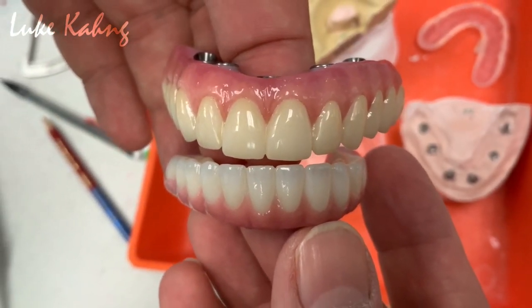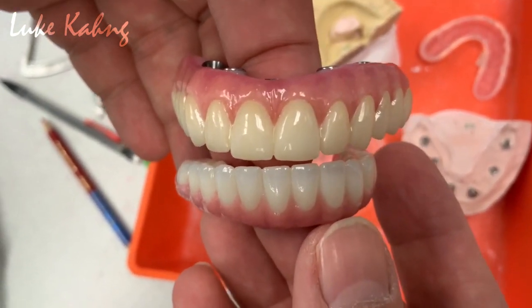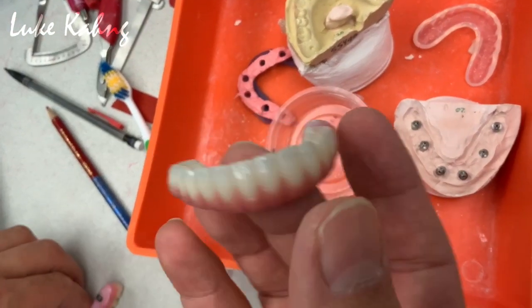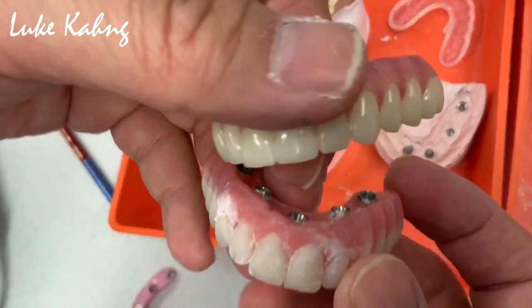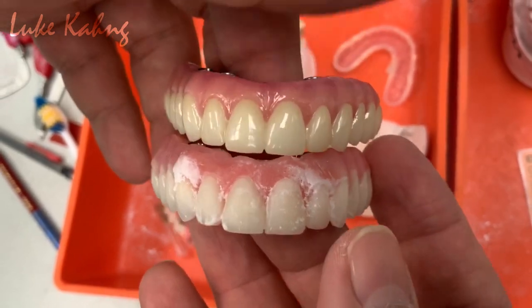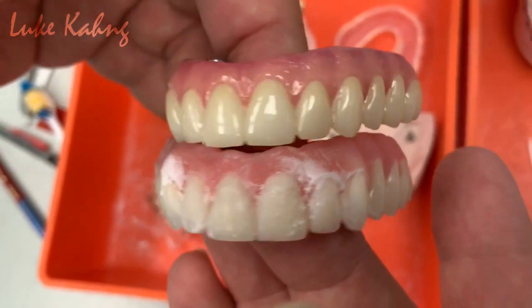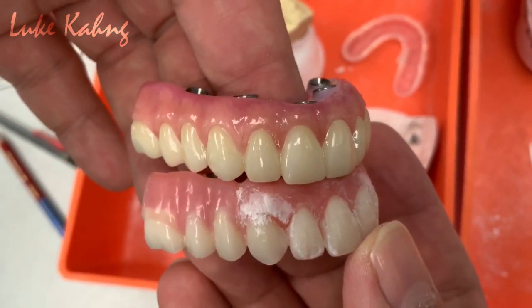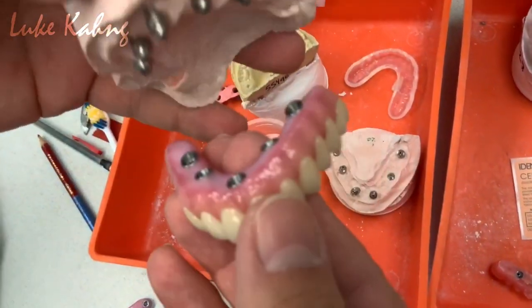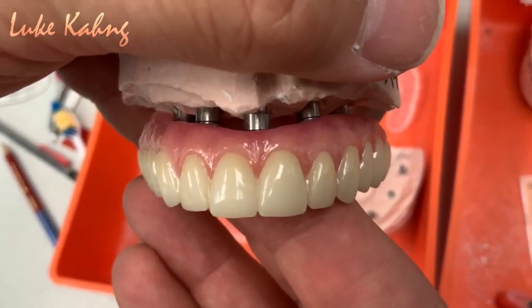Alright, two different cases. The one is the A1, which is mono, solid mono, no translucency. As doctor said, this one has some translucency, Saiten 4500. So, here is their guide. We're trying to mimic as close as possible, and then make the great aesthetics and tissue contour. And then we cement it really good, like that.